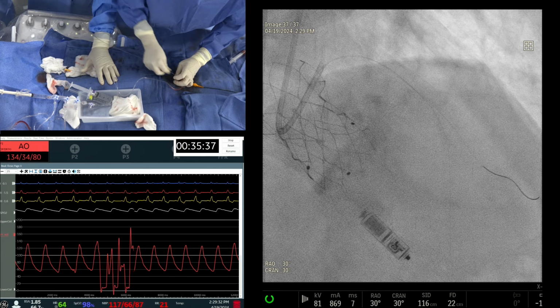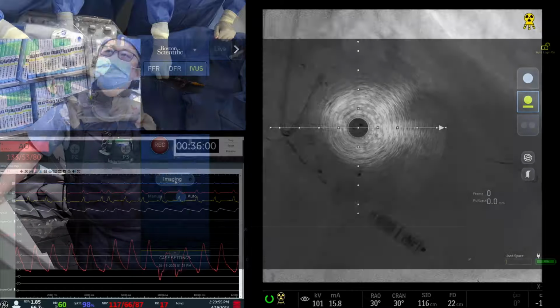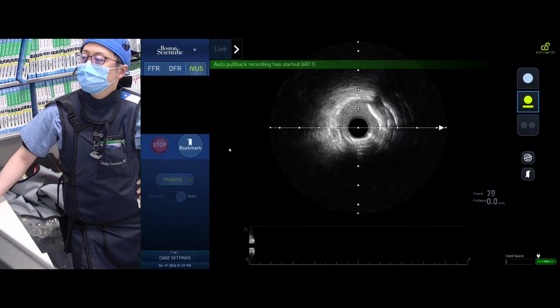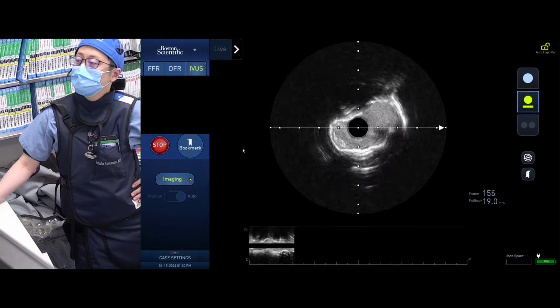So now we are doing the IVUS, going through our proximal LAD, that nodule, and into the large diagonal, and let's see what is happening there. That's where I get messed up, that false sense of balloon dilatation. You think, oh, it fully expanded, and guess what? You're wrong. Okay, could you show the IVUS on the screen? Show the diagonal, please, and now with the IVUS. Good. Okay, start from the lesion. It's in the diagonal, eccentric calcium. Now come to the main branch.